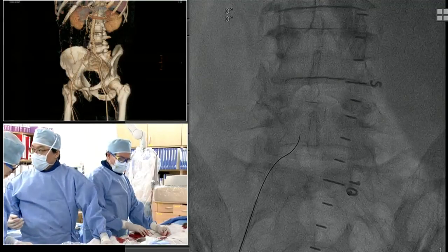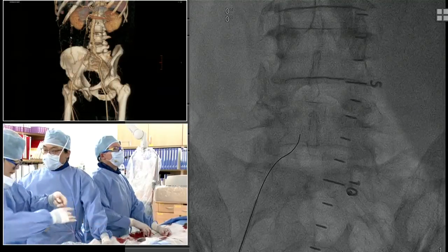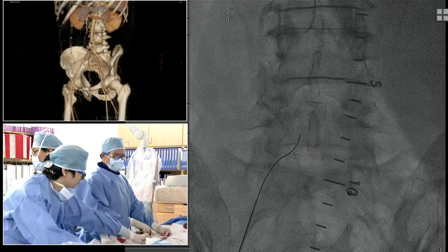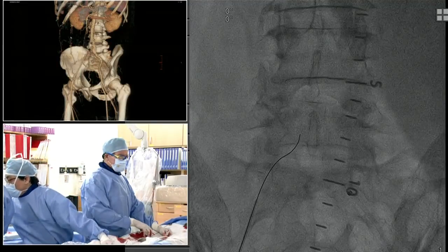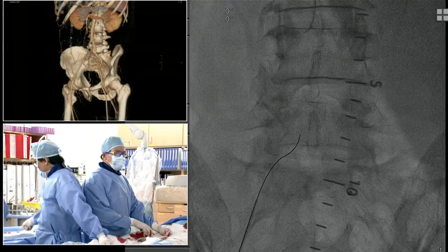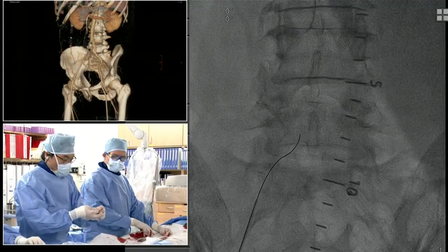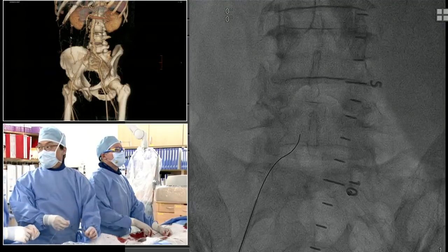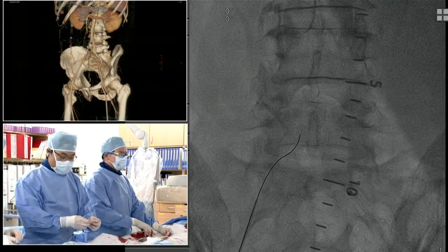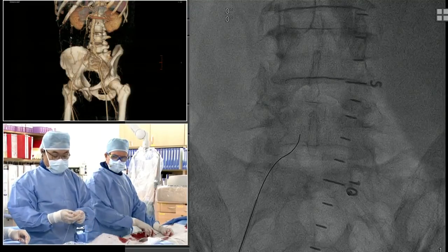Sometimes the guides, like coronary guides or IMA shorts, are probably fine. The other point about the reentry in a case like this is that there is a stump on the right side, it looks like, in the common iliac, so there would be the possibility of reentering into that very proximal common iliac artery, which would be better than having to reenter into the aorta. So an Outback or Pioneer would be an option here.